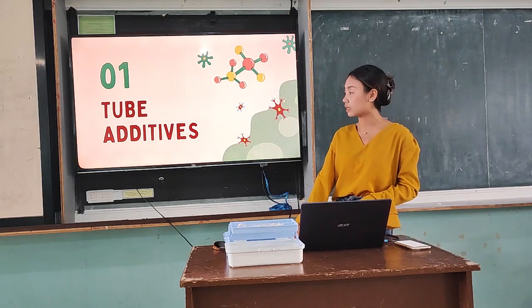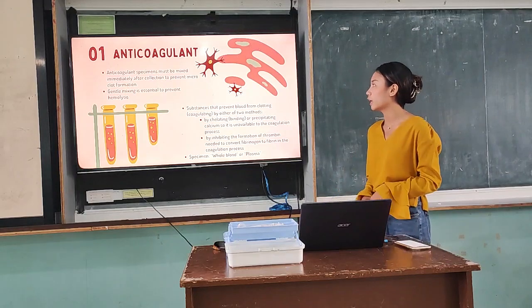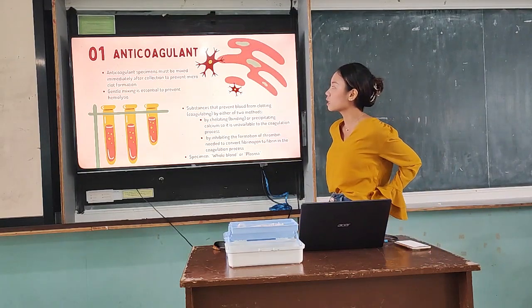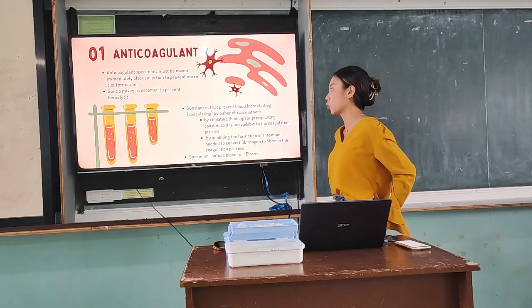First na i-discuss natin will be the tube additives. So we have here the anticoagulant. I think you are all familiar naman with anticoagulant. So anticoagulant specimens must be mixed immediately after collection to prevent microclot formation.